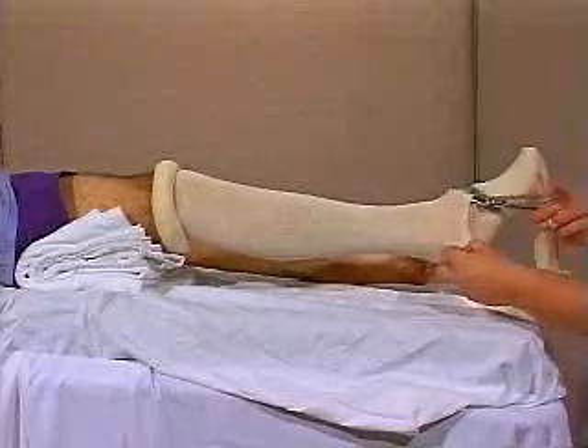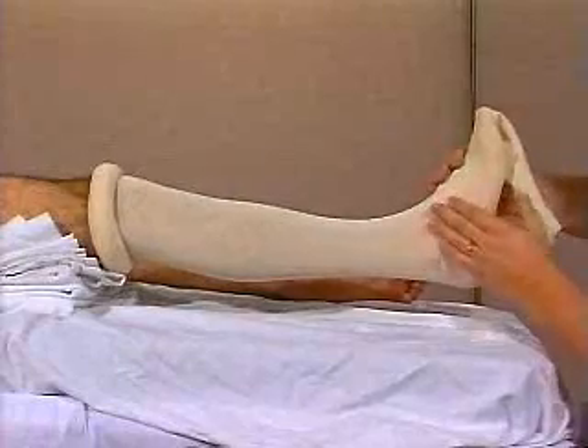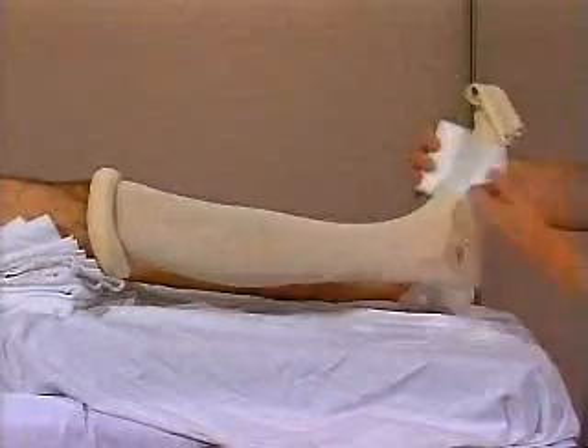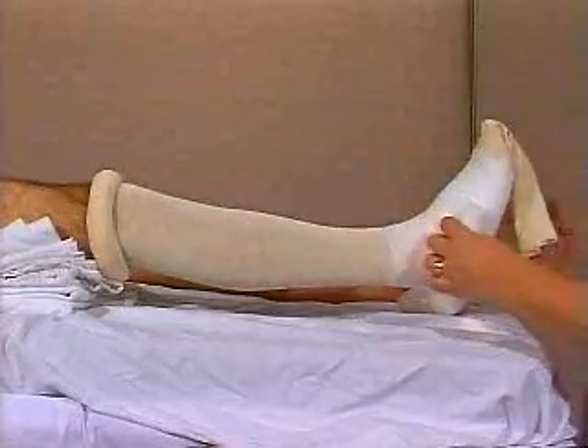Cut a slit in the stockingette at the ankle and overlap the layers. Start the cast padding distally, ensuring five to six layers around the heel and malleoli, with extra protection over the head of the fibula.